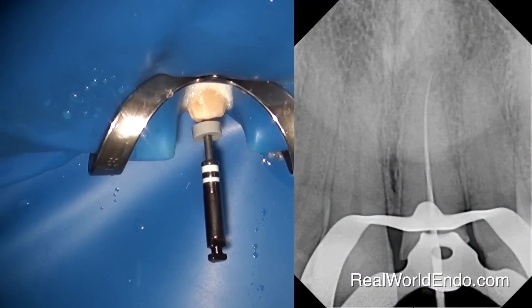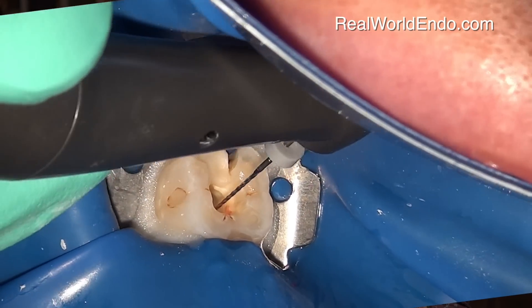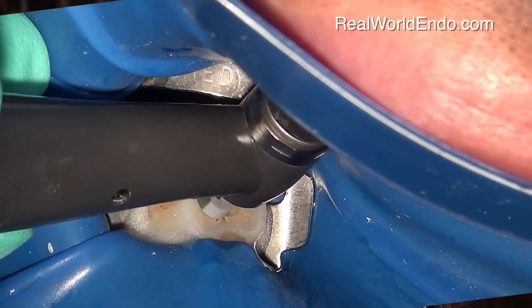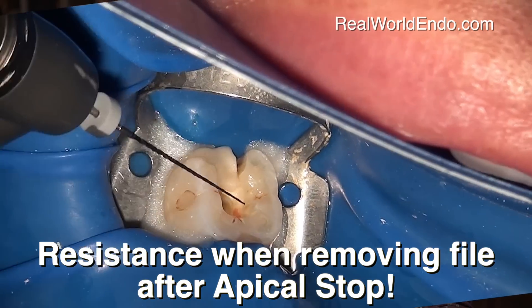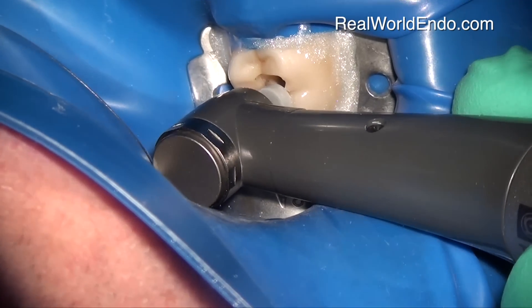Now, the question that had come up — and is something that I have seen clinically myself — is that when the file comes to a full stop as it reaches the apex, the handpiece doesn't reactivate to make the file turn as you want to remove it from the canal. Sometimes it requires a little bit of force. Most of the time it comes out easy after it's stopped, but sometimes if you have a very tight canal and the file comes to a full stop at the apex, it's a little bit hard and some people are uncomfortable with that.